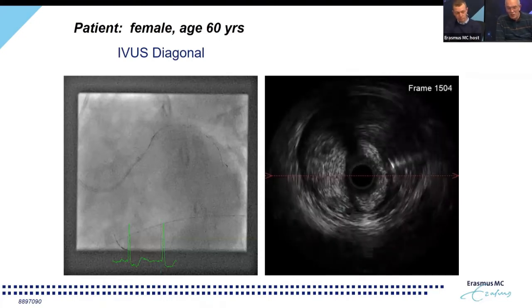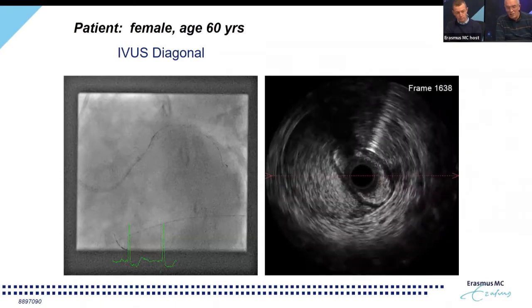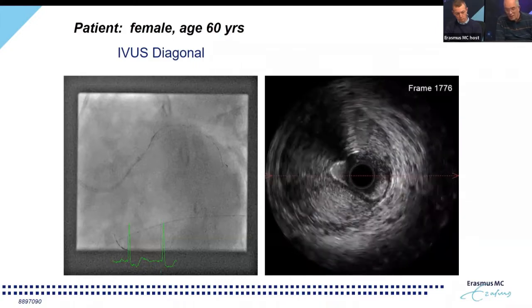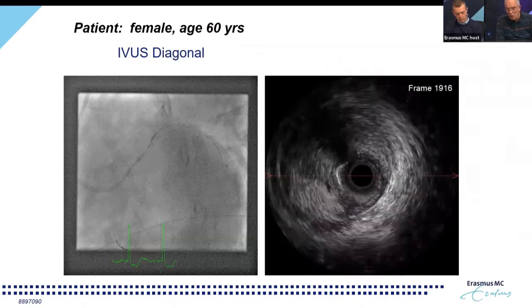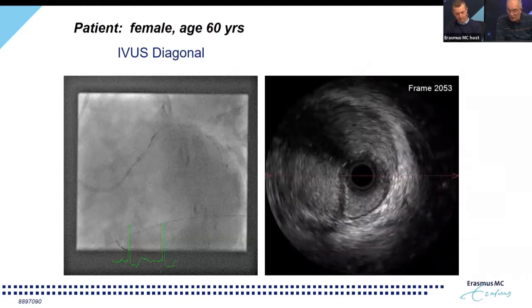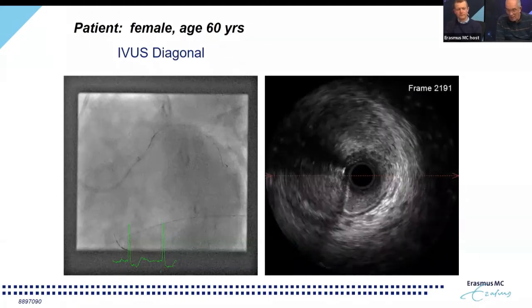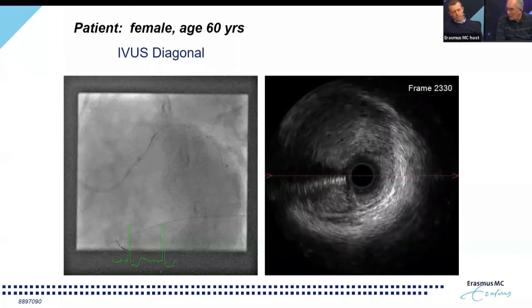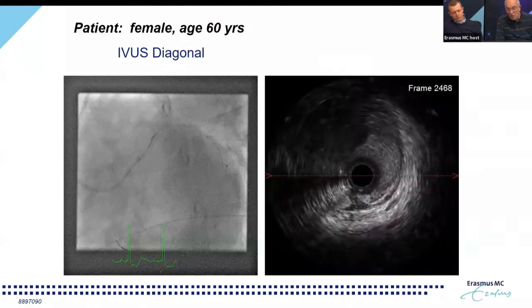Well, you could see that the hematoma was already starting in the diagonal, but here, proximally, you see that now the lumen is compromised by the hematoma. That fits, actually, with an open connection with the hematoma, an anterograde hematoma, that it was filling up like that and didn't cure by itself. And that's the situation that the lady was now in.